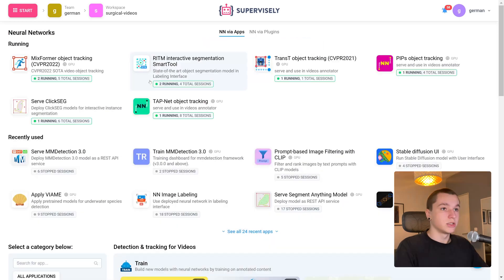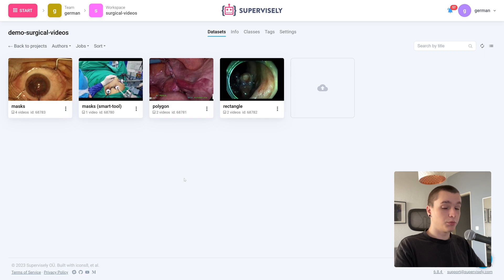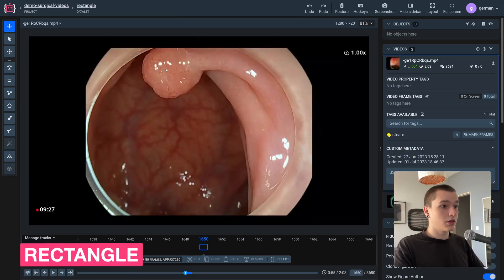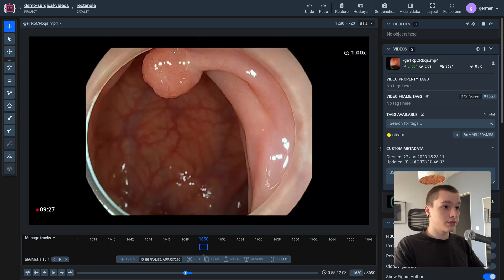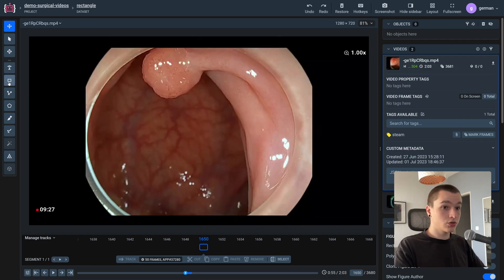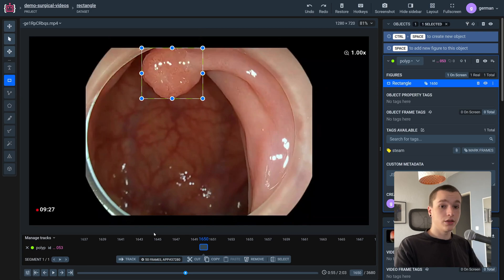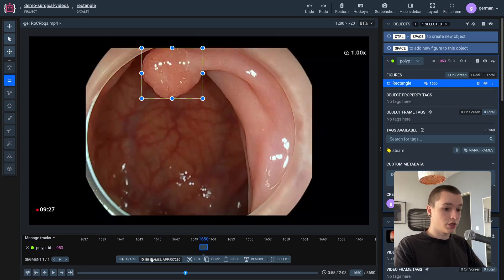Let's head over to the medical data itself. Here I have some medical data and I'm going to demonstrate the three annotation types on these videos. Let's start with rectangle. Here I have the video and I need to label this object. Let's select the rectangle tool, also known as bounding box, and label the first frame by hand. Then the neural network will do the rest of the job — it will track this object automatically.